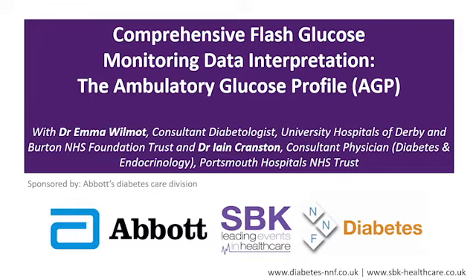So you have this graphic representation that says, for example, at midday, is my glucose level more likely to be 5 or 15? And is there generally a direction of travel that's happening at midday? So it gives me an idea of saying, if I'm usually at 5, but my sugars are usually rising, then I know that I'm likely to be fine.